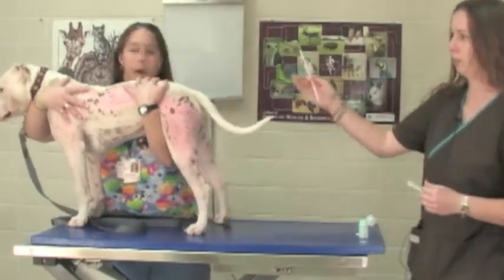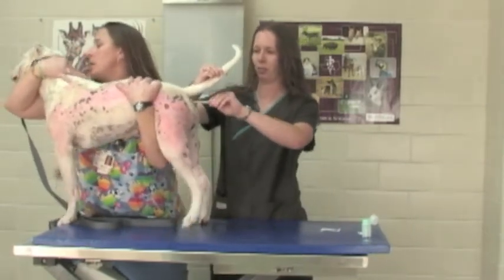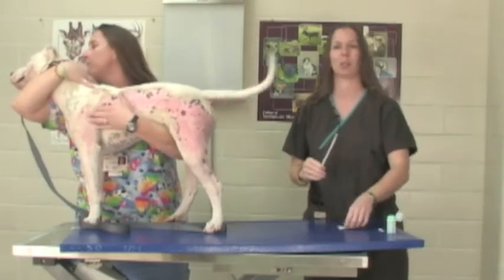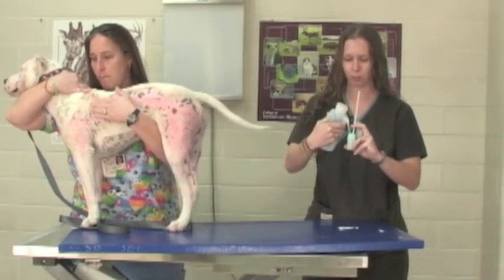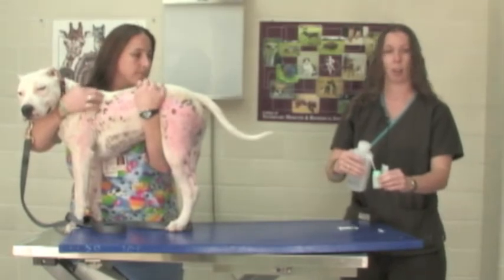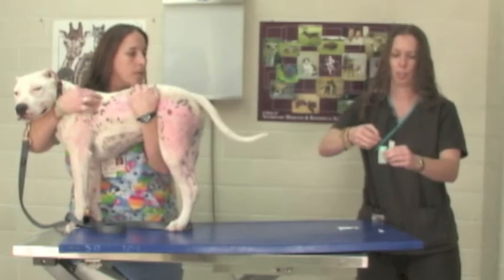We need someone to restrain the patient's head and make sure they don't jump off the table. We obtain our fecal sample, and once we have our sample — always praise your patient for being good! We can place our sample into a cup and use some flotation solution, and we will float the sample in the flotation solution. On top of our flotation cup we can place a cover slip from a microscope slide and place that on top.